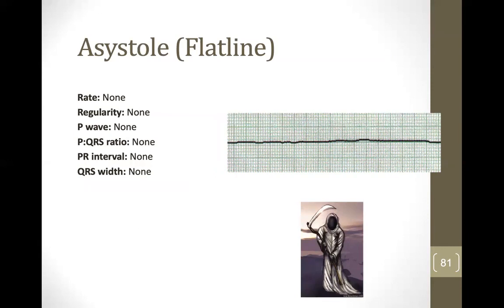A means it's not. So this is no electrical activity in the heart whatsoever. This is what we know also as our flatline. Flatline, no electrical activity.